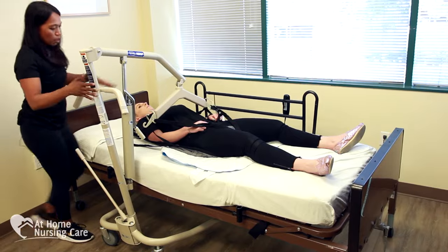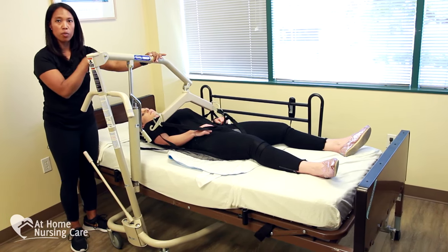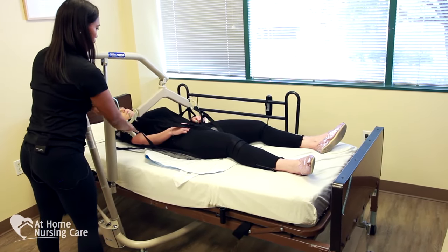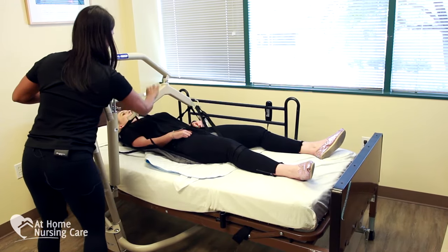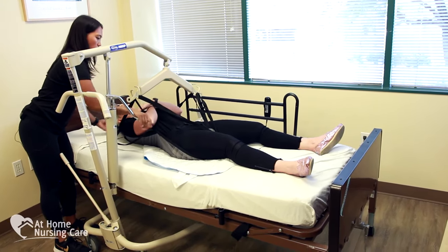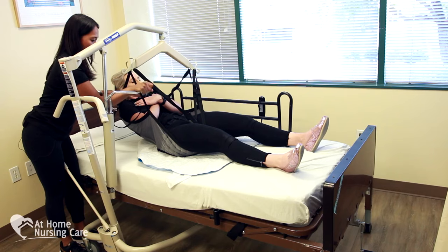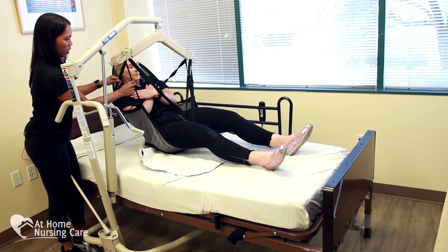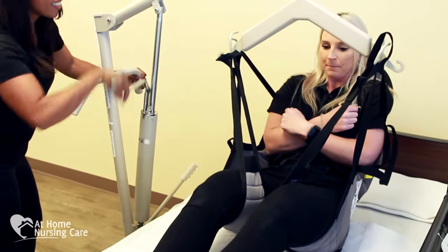Always double-check. When we're ready, we're going to add a little bit of pump to create tension and then recheck our straps. Turn the valve clockwise to create tension and raise the Hoyer Lift using the pump. As you're pumping, make sure you're supporting the head, and have her cross her arms across her chest. As she starts to sit up in the sling and gets about an inch or two off the bed, recheck the straps. They all look good. Are you comfortable? Continue to pump until we get clearance from her hips and legs.